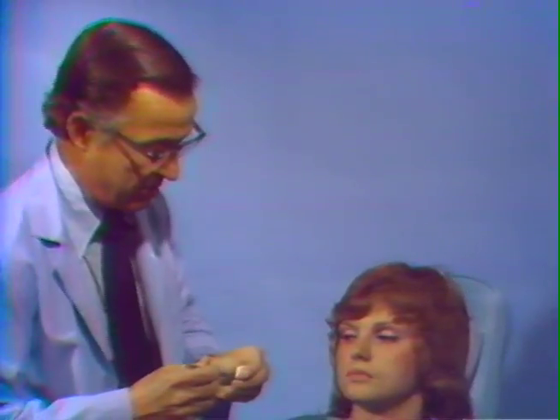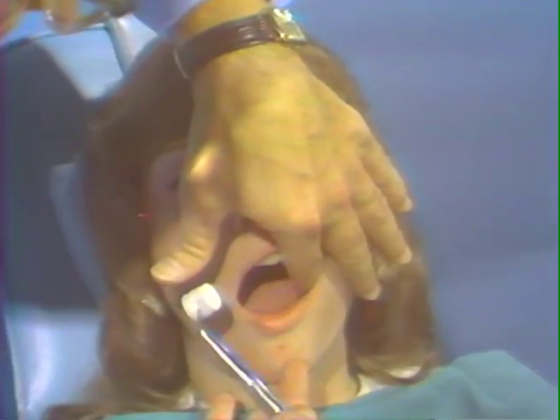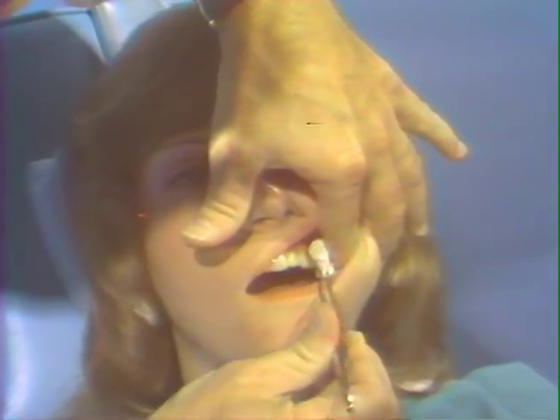I will now demonstrate the multiple sites to produce topical analgesia intraorally. Points to notice for each of these sites are verbal commands, head positioning, and tissue retraction. I will now demonstrate the cotton roll placement for the posterior superior alveolar nerve injection. Betty, will you turn your head just a little towards me? Open your mouth. Let me pull your cheek to the side, but don't let me turn your head. Close down just a little bit. Fine. Now close your mouth.